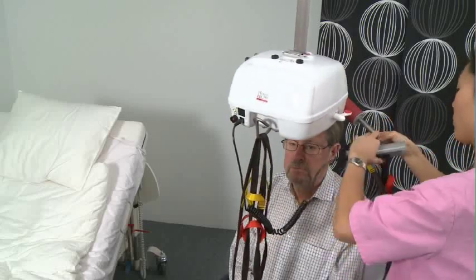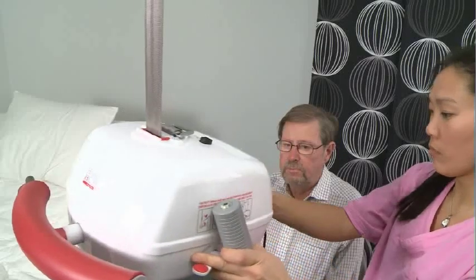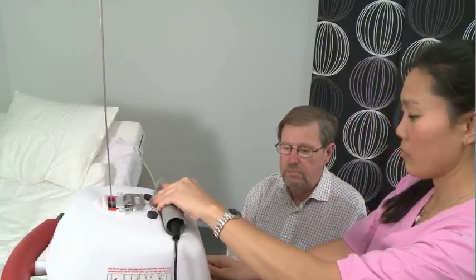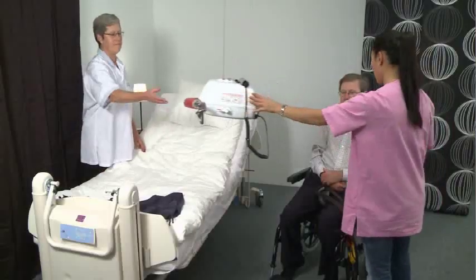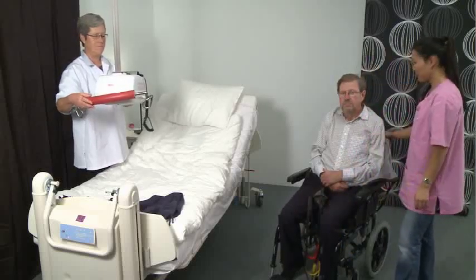Release the straps from the hoist unit. Take care to keep the unit away from the client's face. The harness can be left in place under the client, but all harnesses with handles or reinforcements have to be removed after the transfer.